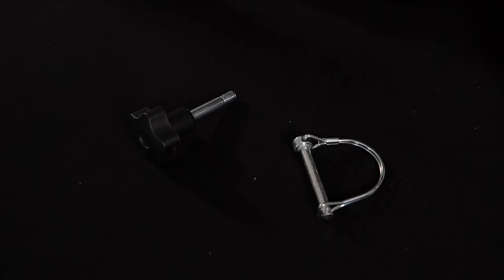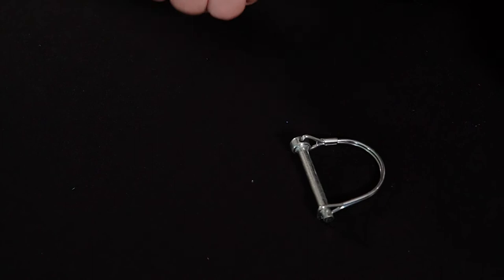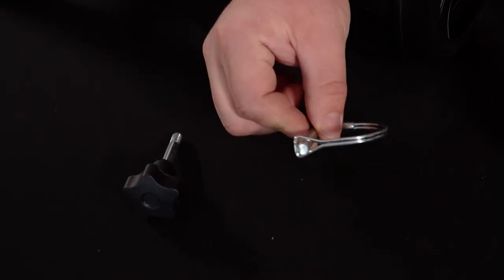Alright, to assemble the scooter, all you'll need is your height adjustment knob and your knee pad locking pin.